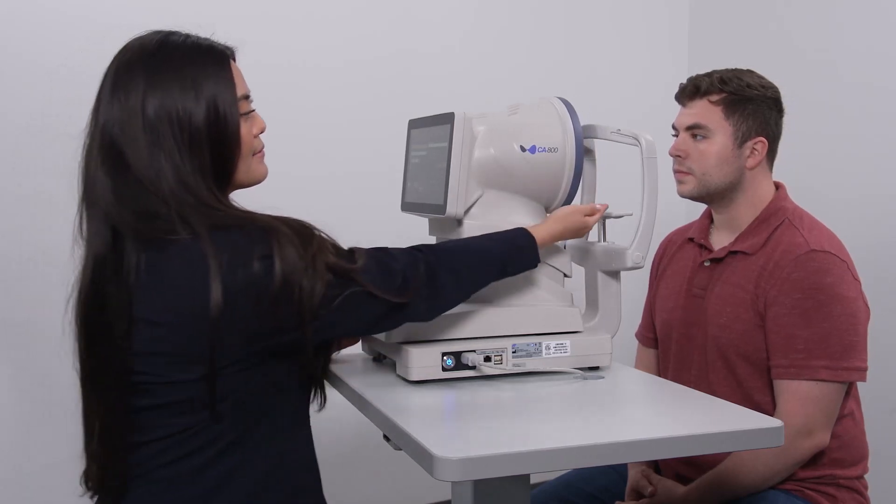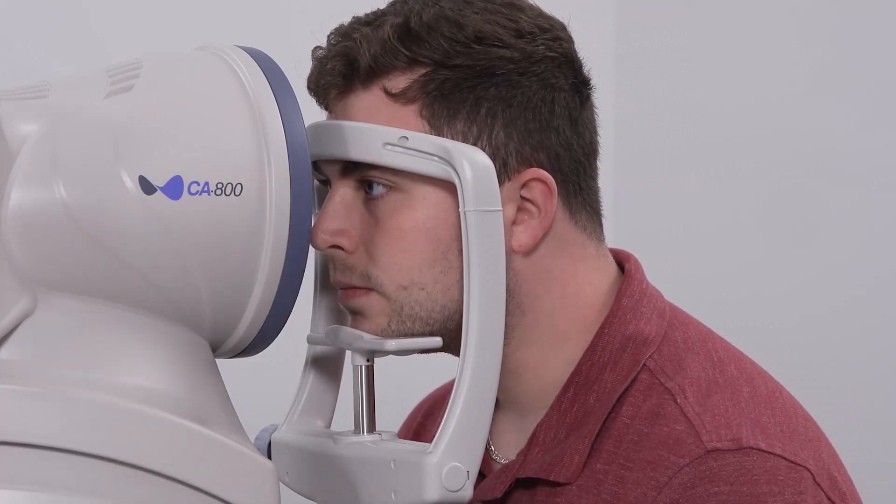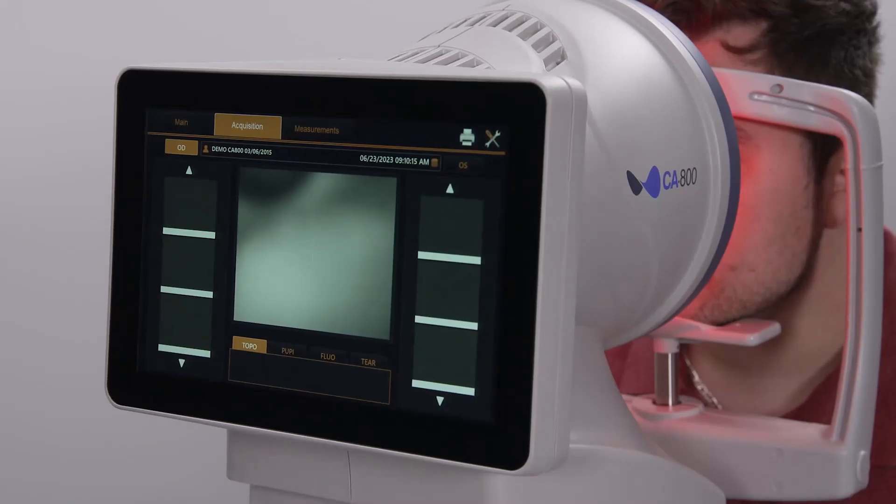Position the patient so they have their chin down and forward in the chin rest and their forehead forward against the forehead rest. The CA800 enables you to capture and quantify the tear meniscus height to support dry eye diagnosis and monitor changes over time in response to treatment.